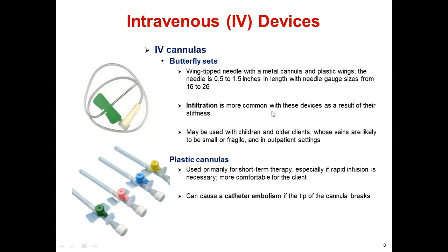Infiltration is common with this device as a result of its stiffness, or it may be used with children or older clients. Those veins are likely to be small or fragile. An older person has small, fragile veins. A pediatric child has a small vein.